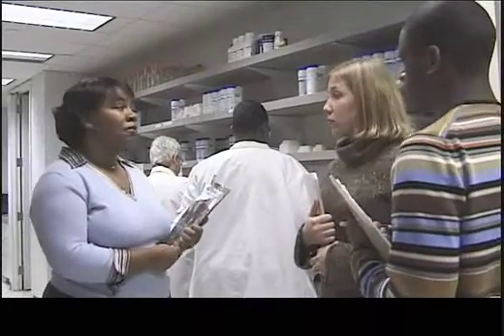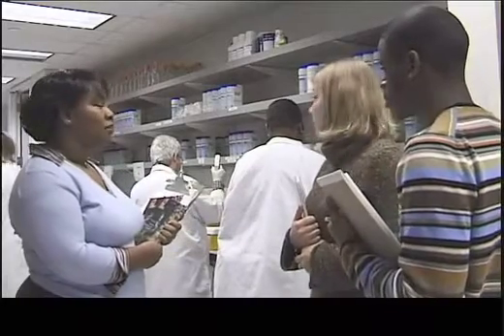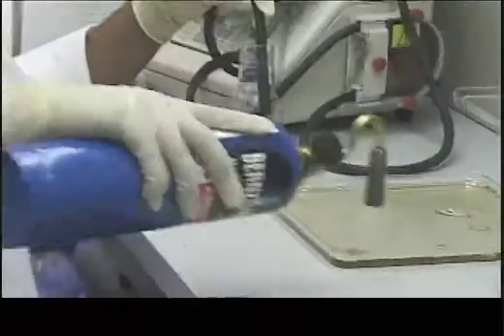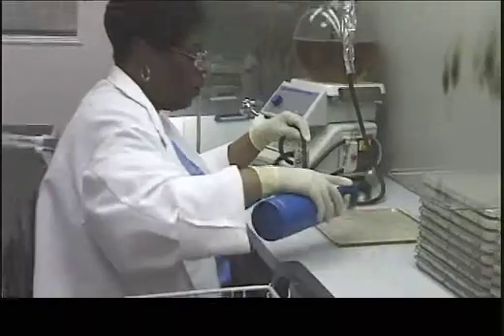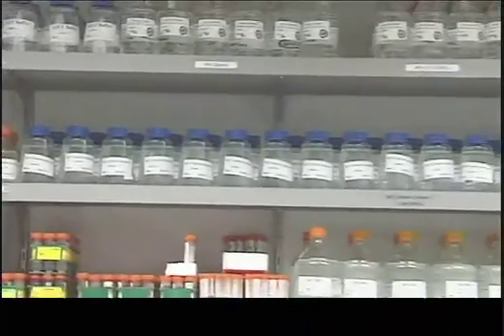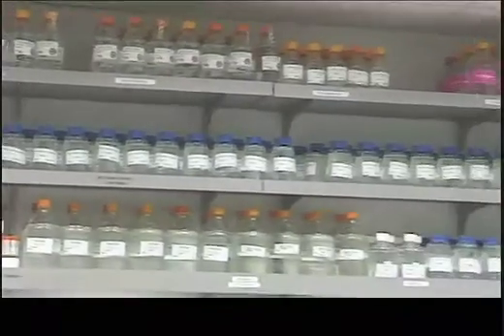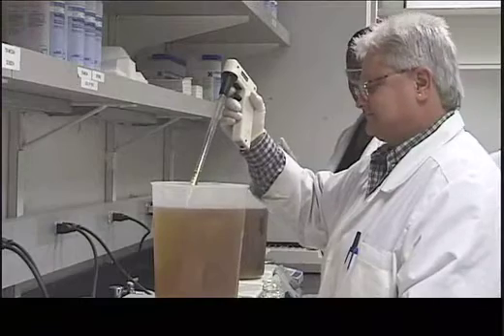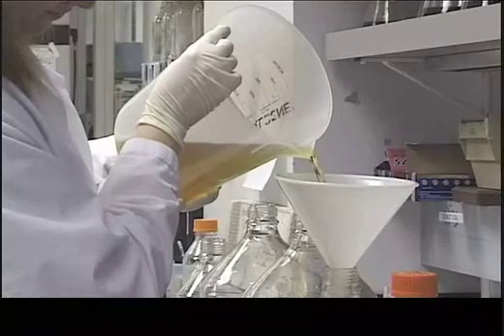There are two groups that provide support to each of the groups in the Genome Sequencing Center. Those groups are Media Core and Materials Core. In Media Core, they prepare all of our liquid growth media as well as pour all of our agar plates. In Materials Core, they provide solutions for every single step in the process. In Media Core, they prepare over 10,000 plates each week and over 2,000 liters of liquid growth media. They also sterilize all of our glassware.